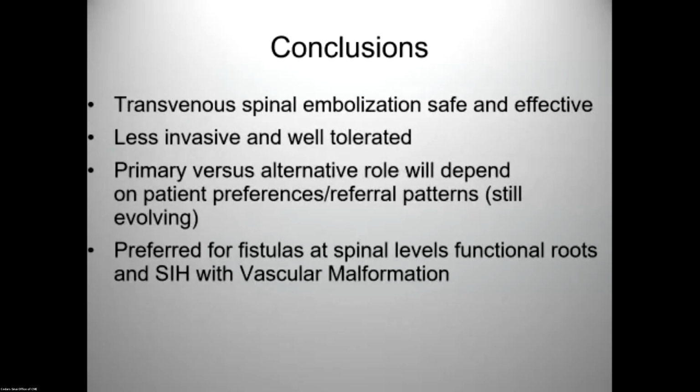In conclusion, transvenous embolization is safe and effective, less invasive, and well-tolerated. The role will be really based on the referral patterns and, importantly, patient preferences. There is a preference for fistulas where there are functional nerve roots and in patients with vascular malformation. Thanks very much for your attention.